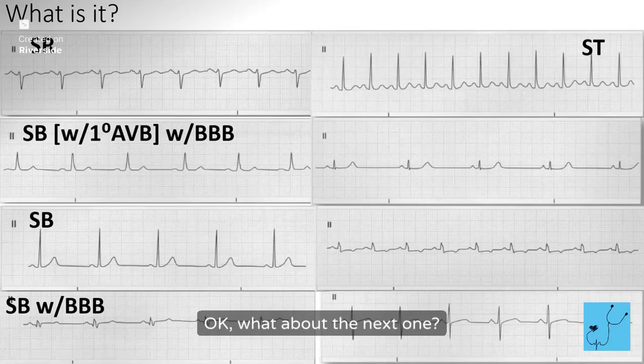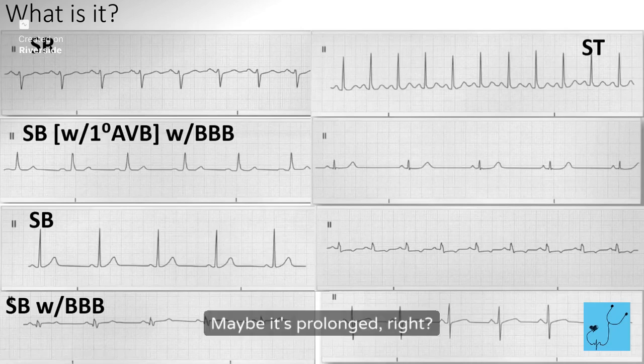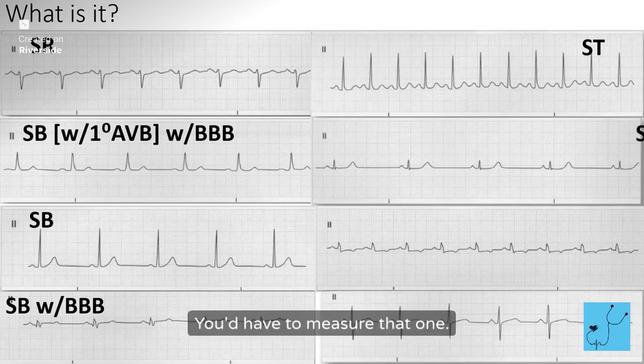Okay, what about the next one? It's Brady. What about the QT here? Maybe it's prolonged, right? It's a couple of big boxes. It's hard, you know, you'd have to measure that one. So sinus Brady. But this one?